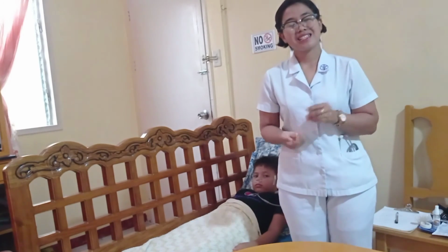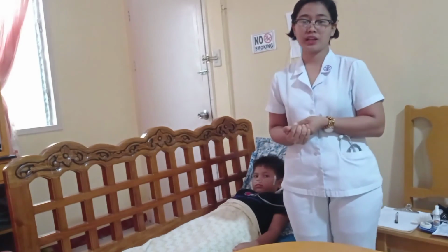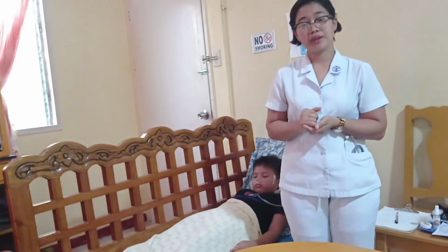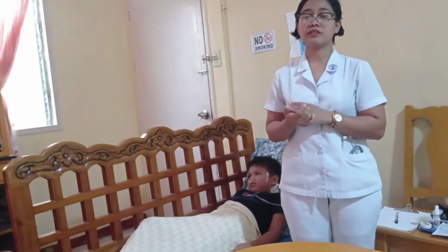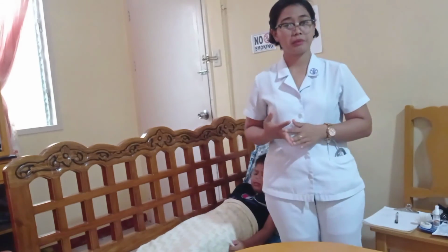This is to prevent the spread of infection. Lastly, I am going to document the findings of my client by recording using forms or checklists supplemented by narrative notes when appropriate. The rationale for this is that it is part of the 10 rights of drug administration. The record gives a correct account of the therapy and care provided for our patient.